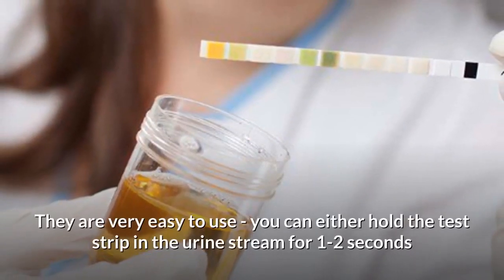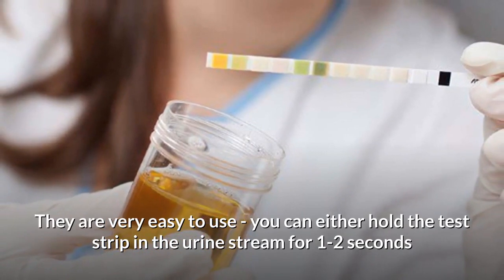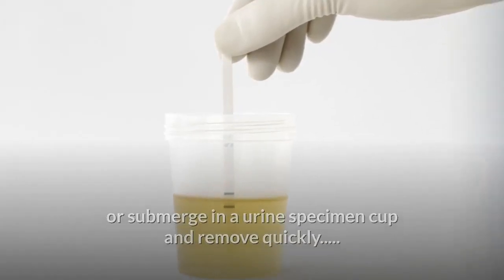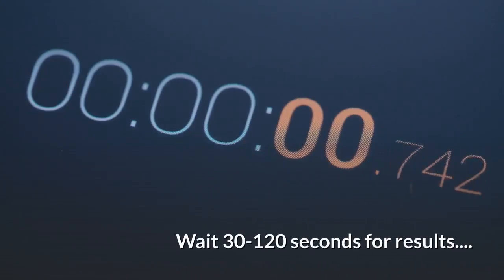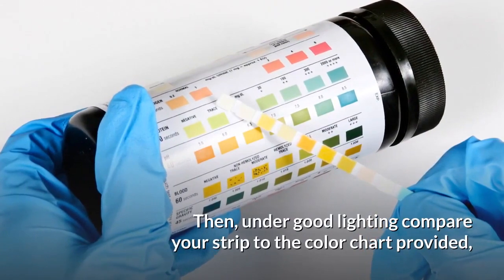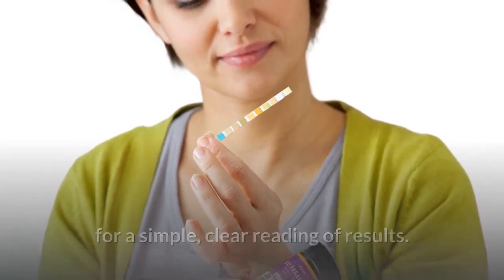They are very easy to use. You can either hold the test strip in the urine stream for 1-2 seconds, or submerge in a urine specimen cup and remove quickly. Wait 30-120 seconds for results. Then, under good lighting, compare your strip to the color chart provided for a simple, clear reading of results.